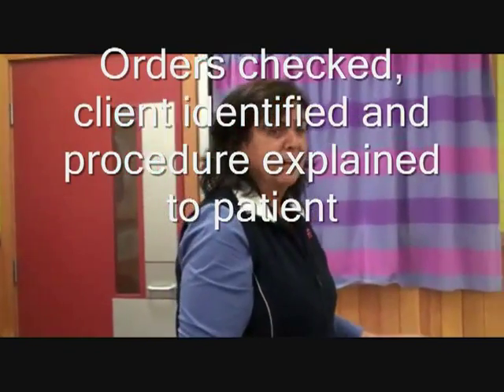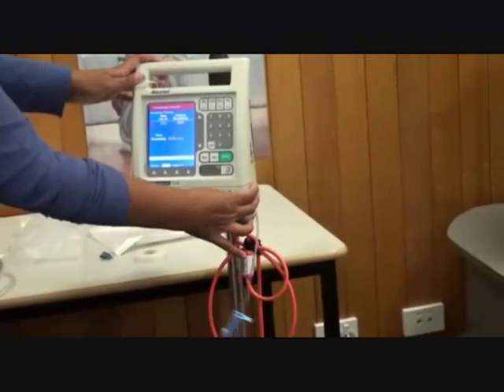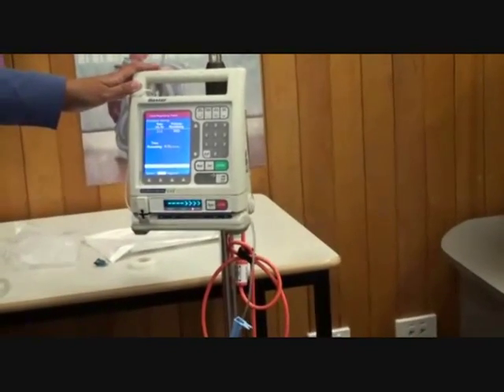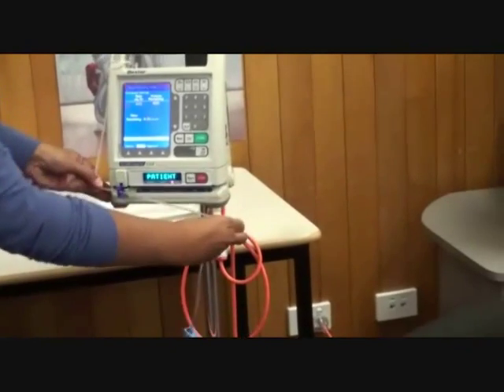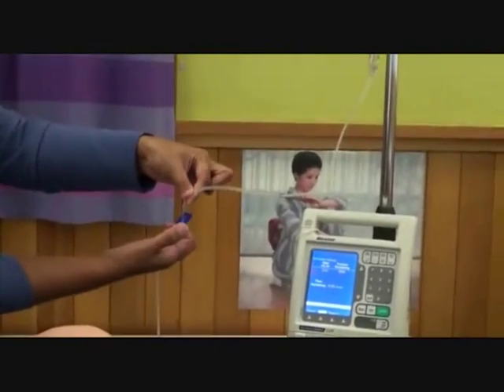About to remove the IV now. Medical orders are to remove the IV and the IV line. Clamp it off, stop it, open it. It comes out clamped off there as well.